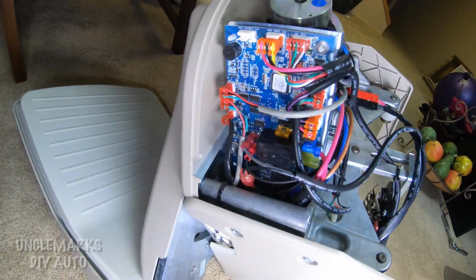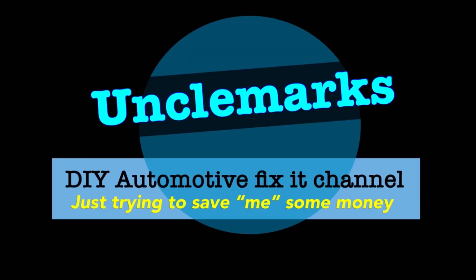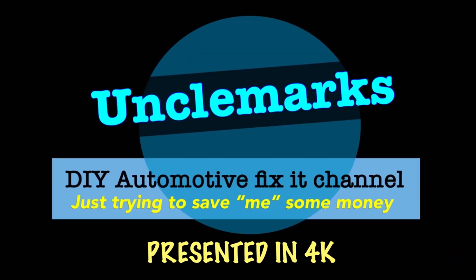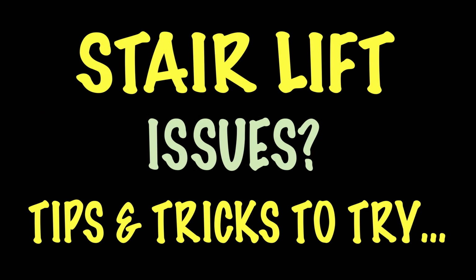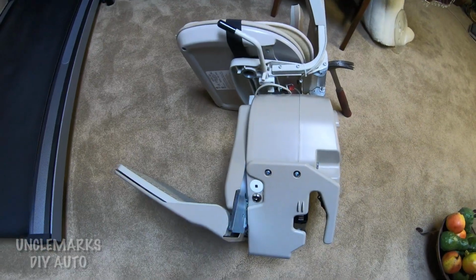I'm Uncle Mark, just working on a stair lift. Going to give you some points and tips as to maybe if yours isn't working, what you can look at, for free. Maybe you can test it and do a couple things that might get it working. Tips and tricks. It doesn't have to be this exact same unit. They're all kind of similar, with similar kinds of ideas.